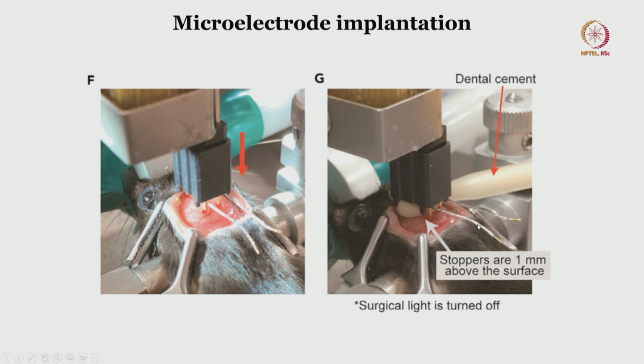So, that will help us to identify the muscular activity during the seizure or any seizure inducing activity, or any cortical stimulation if you want to perform. That EMG is going to give us the feedback, and it also tells us what is the artifact happening because of the muscle movement, where the awake and behaving rats give a lot of muscular signals. If you have that as a reference point, your interpretation of the electrocorticographic signals is going to be very useful.